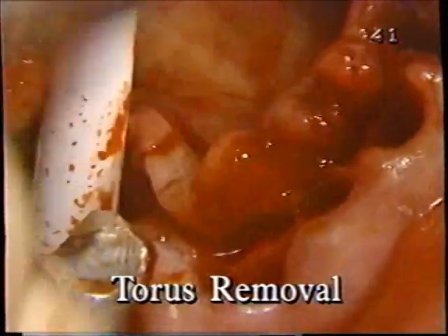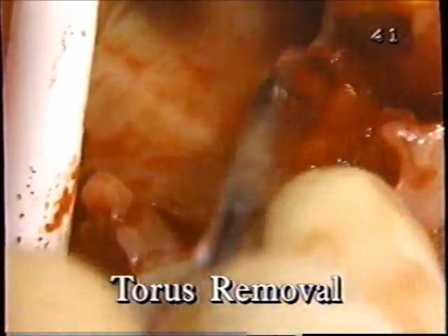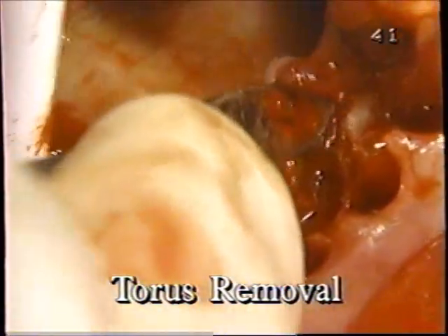Okay, we'll reflect the envelope down to the floor of the mouth and try not to go beyond that. If you have to, you have to, but I don't think we do.